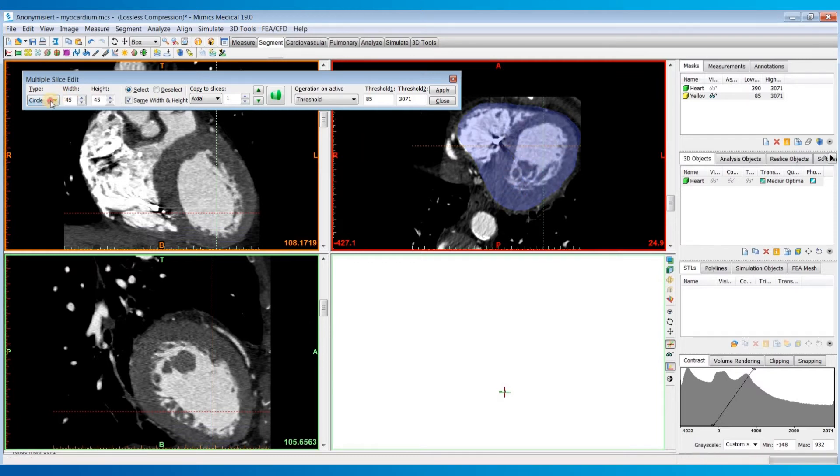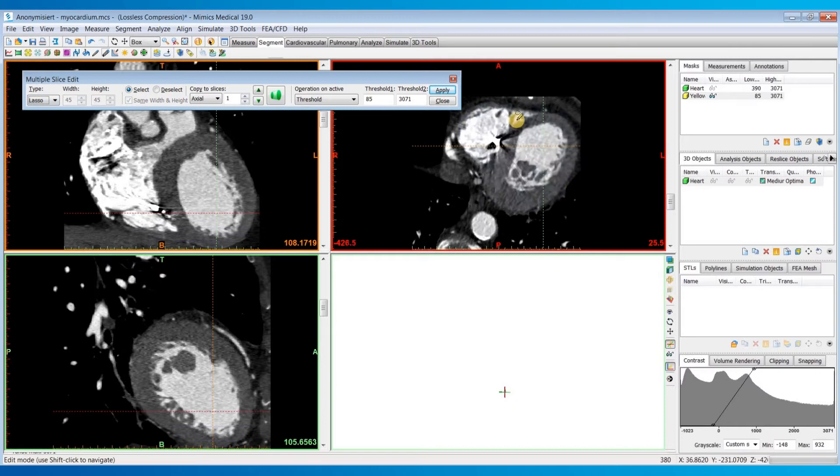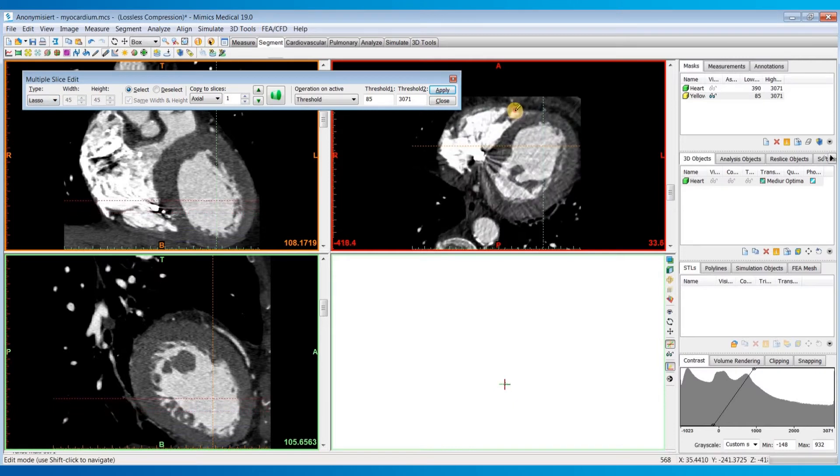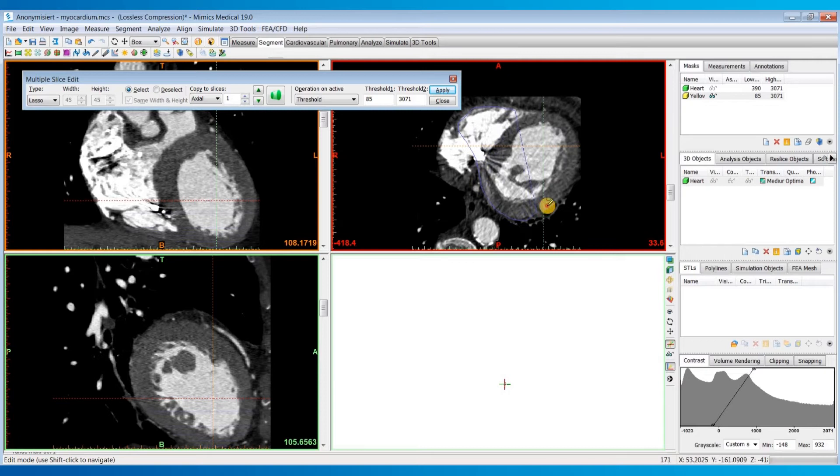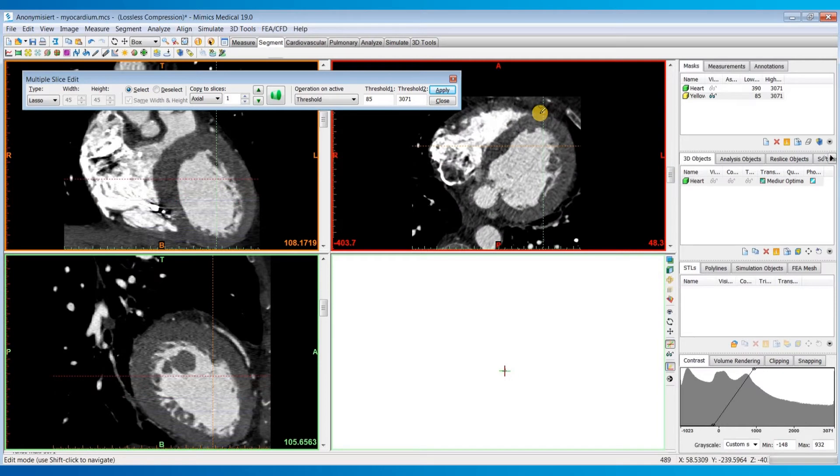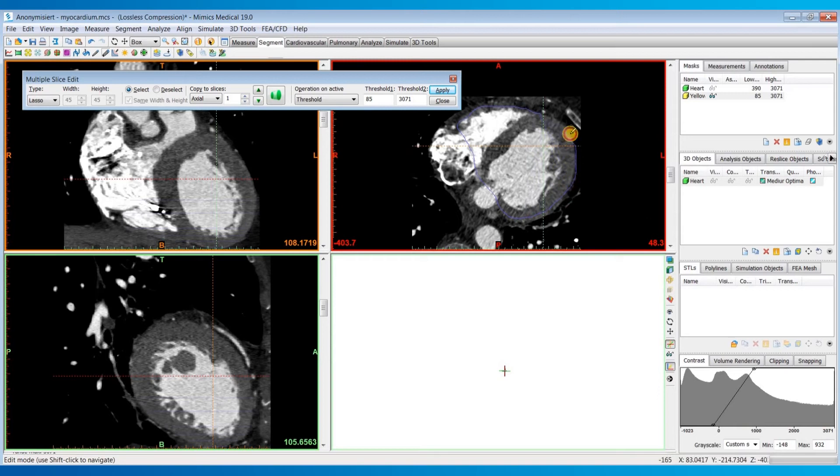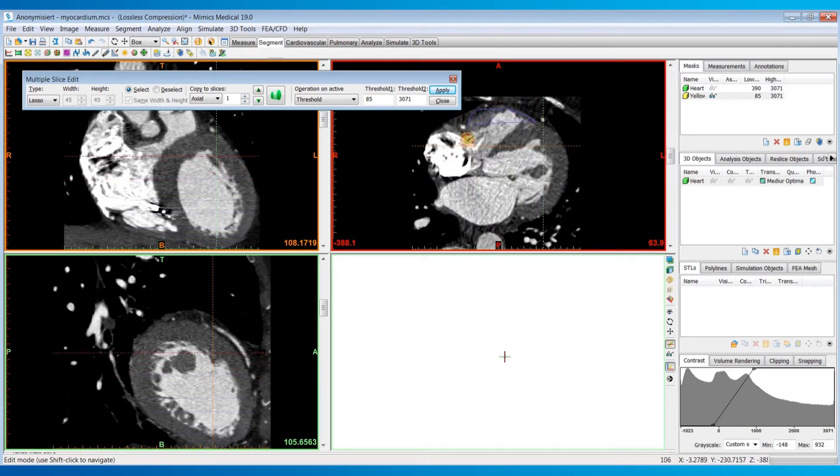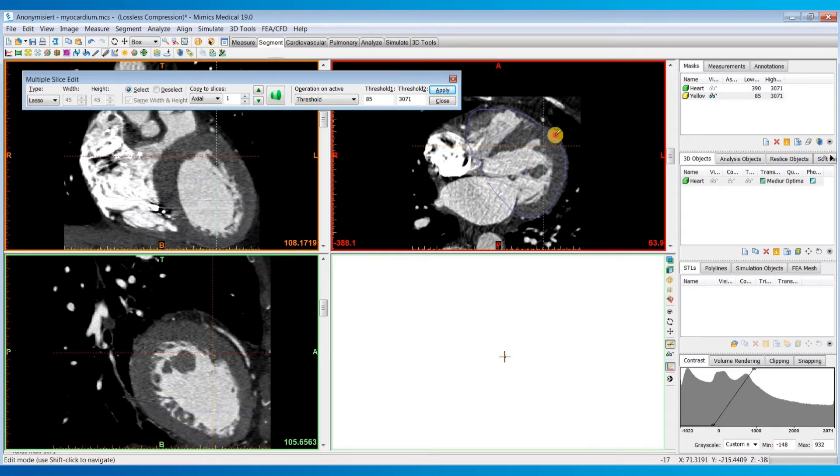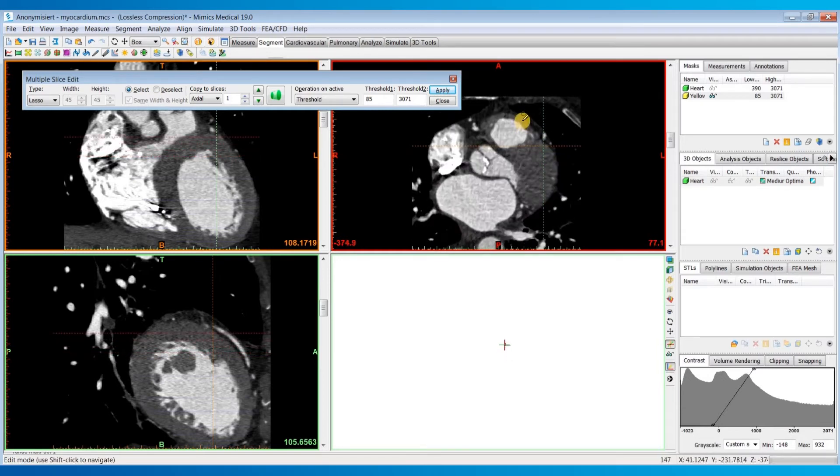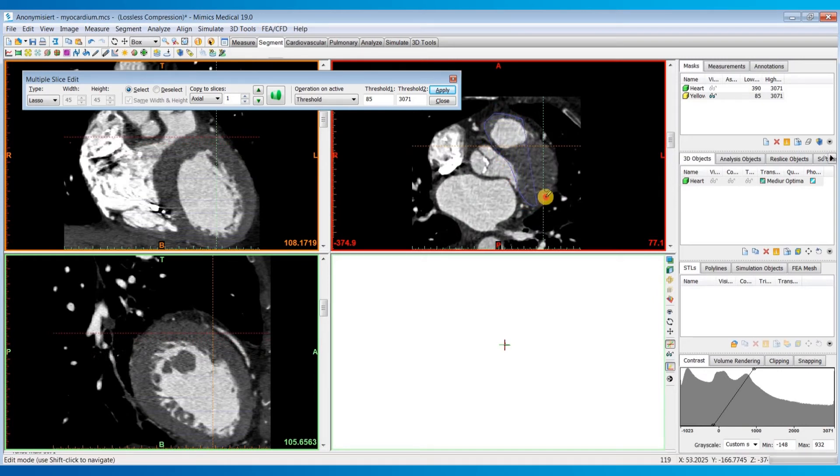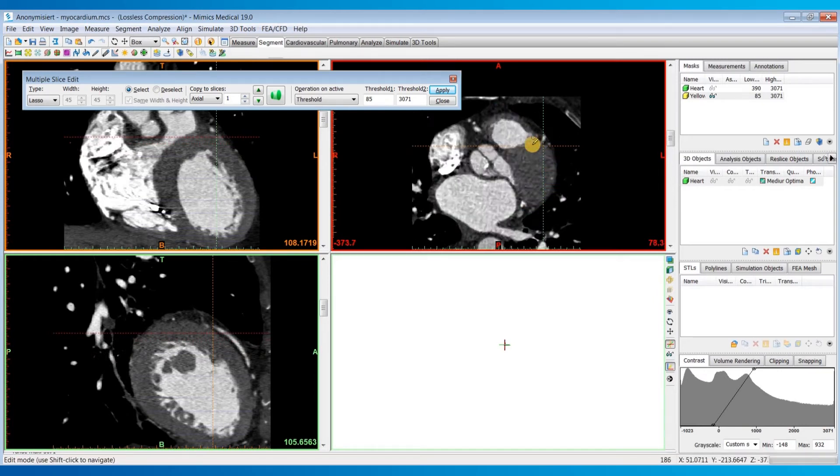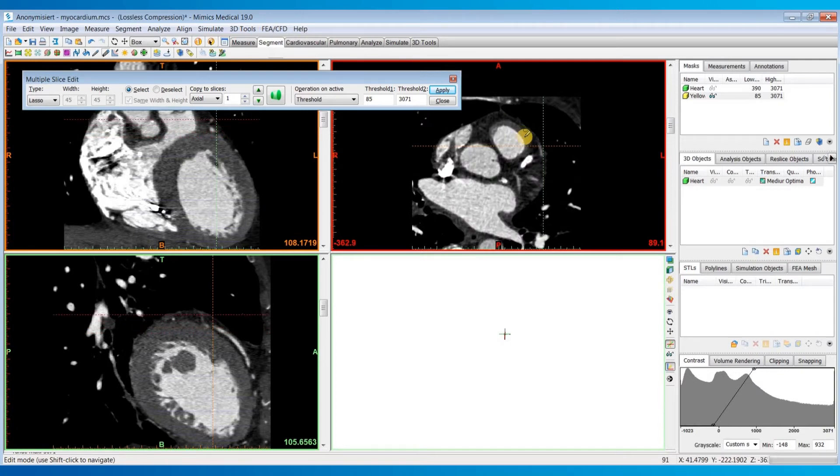If you'd like, instead of the circle, you could also use the lasso tool to mark this outer boundary.